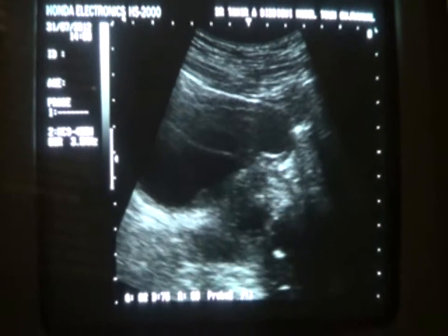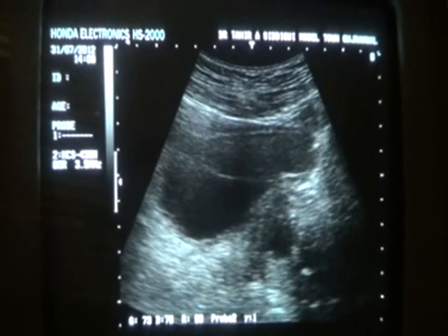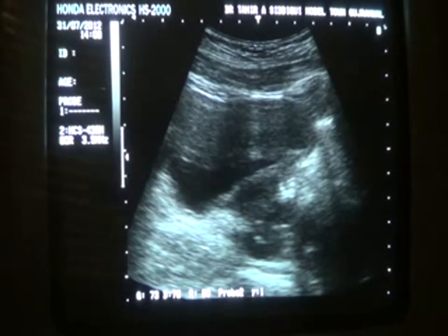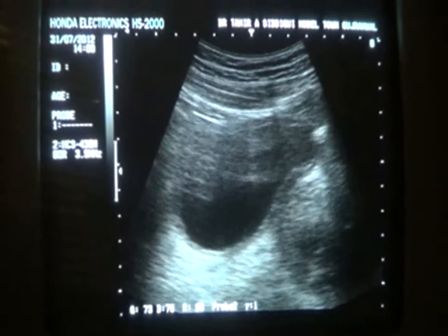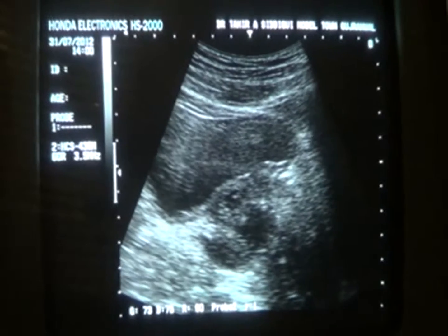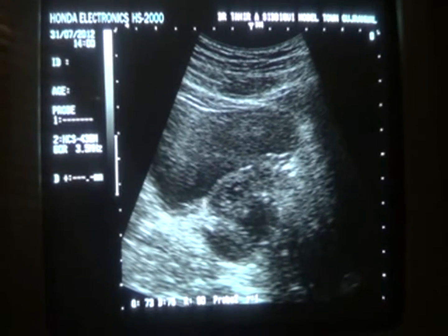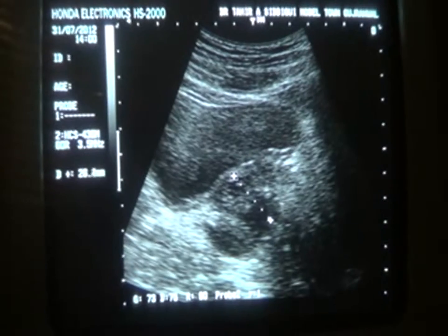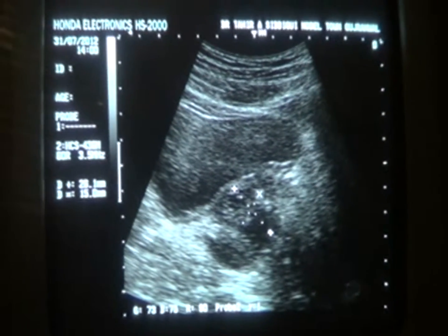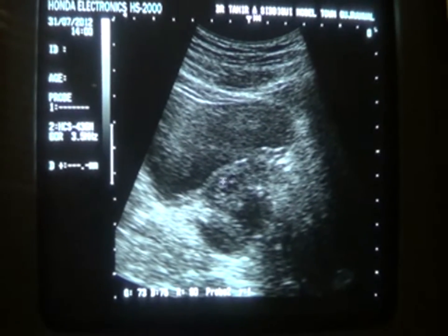What do we see in the longitudinal section? Do we get the same picture or not? Now here, if you see, there is a cystic area. This is the 90-degree angle, and this is the cystic area. This is the prostatic urethra. It's clear. Now this is the cystic area, measuring again 26 by 15 millimeters, and you see that there is a lot of debris within it. Those marginal calcifications are also seen.